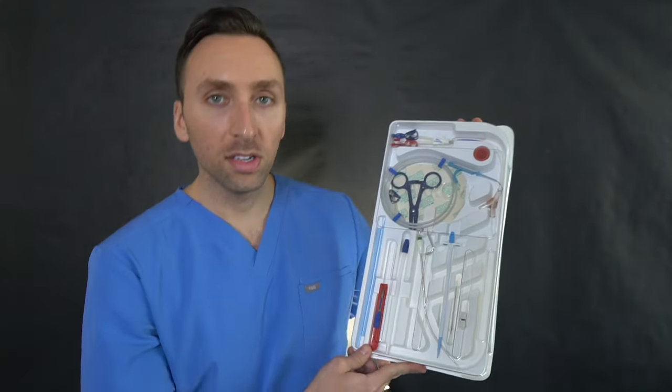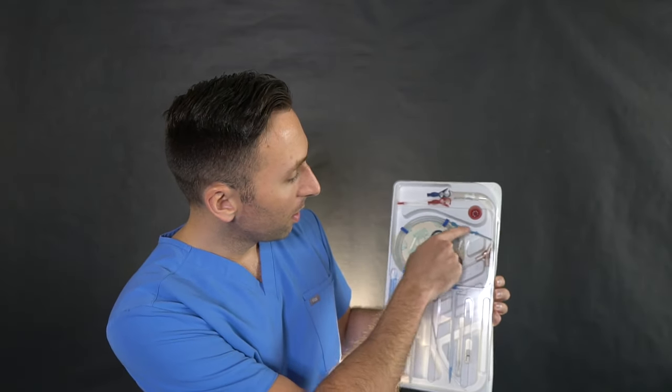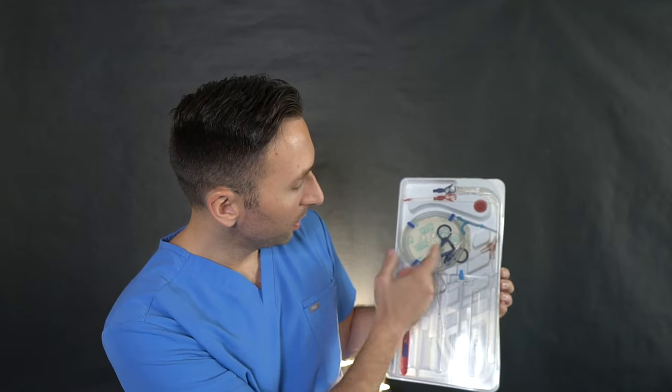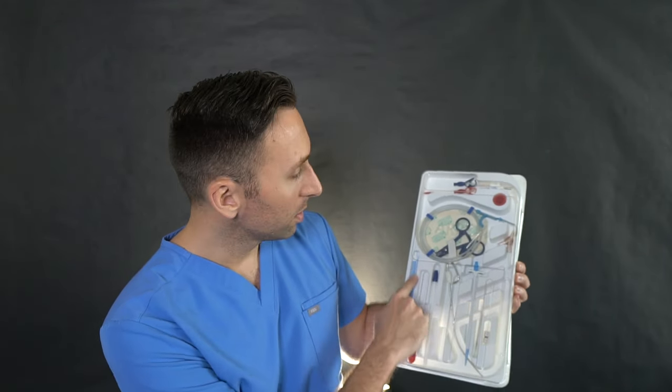Let's open this thing up — this is going to be loud. So obviously we have the sterile cover. The tech would open the dialysis catheter and dump this on the field, and I would open it. Let me show you what's inside. As you can see, we have everything: the catheter up here, our guidewire, a clip which we don't need, our tunneler, and our sheath and dilators as well.